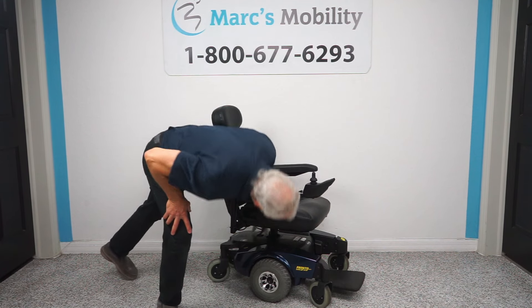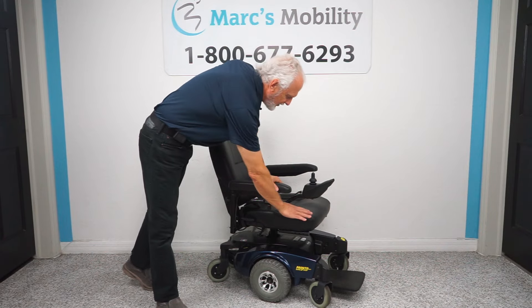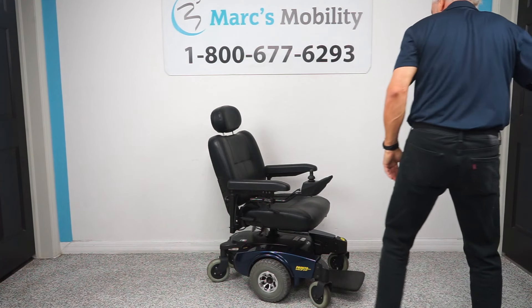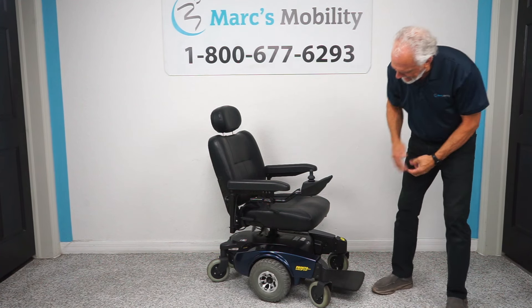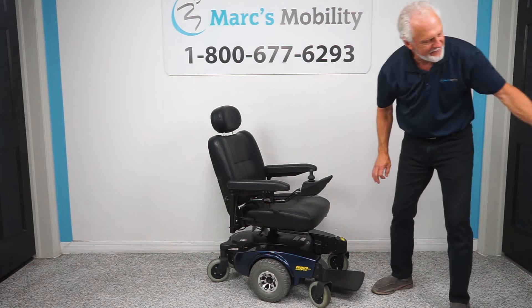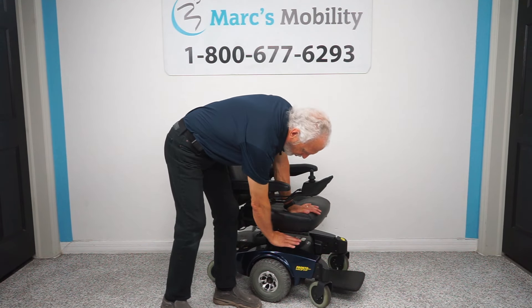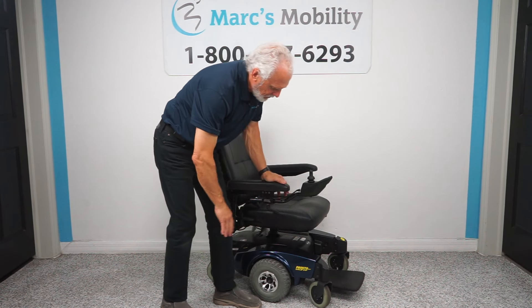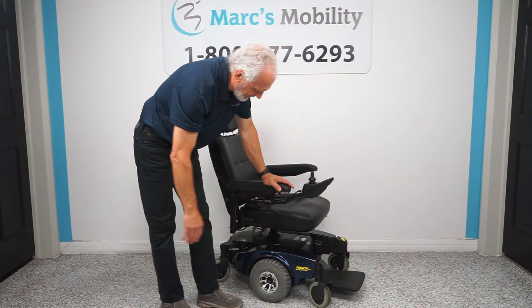What also makes this chair really nice is the seat can be dropped down to almost 19 and a half inches. Right now it's sitting at about 20 and a half inches. We can drop it down one more hole and bring it to 19 and a half. It's very rare you can find a chair that will go down that close to the frame.